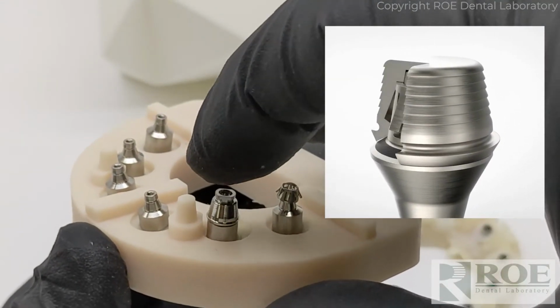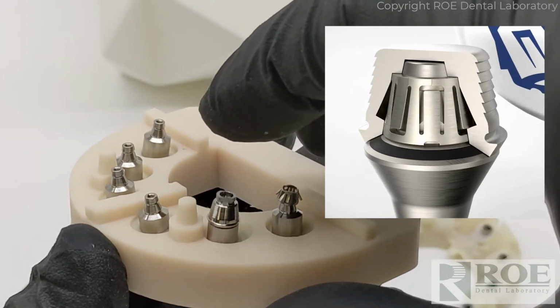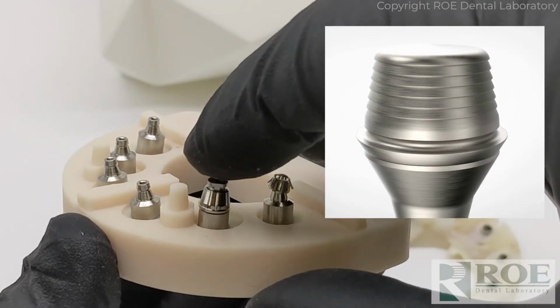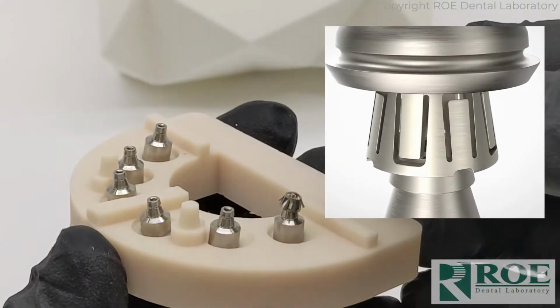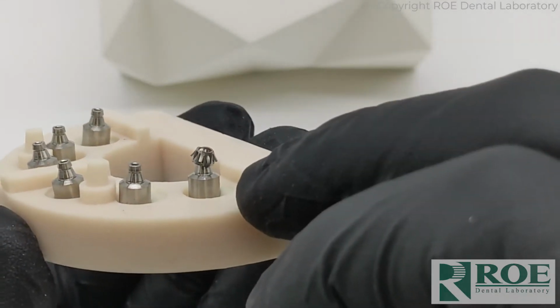Once it's clipped in, it does not come out without the Smilekey. So it's kind of like locators or other snap-in type of attachments, but they lock in because this coping locks in with the little fingers. See the little fingers here?